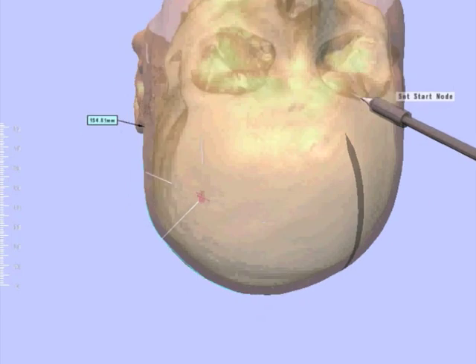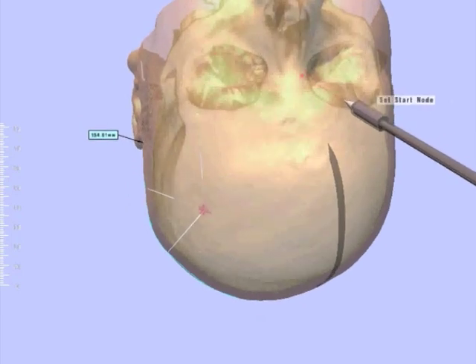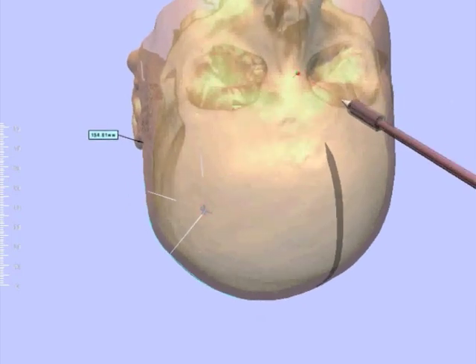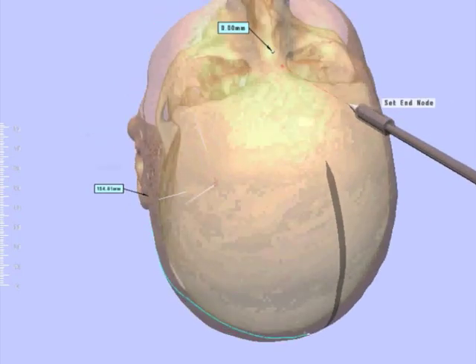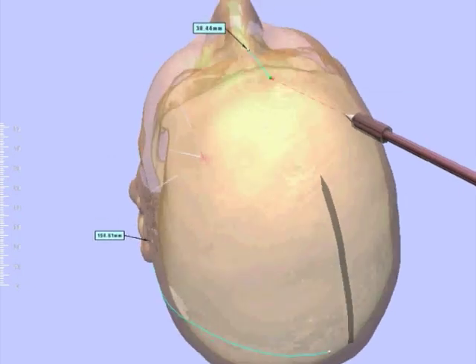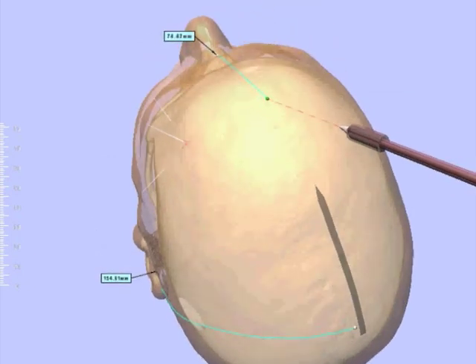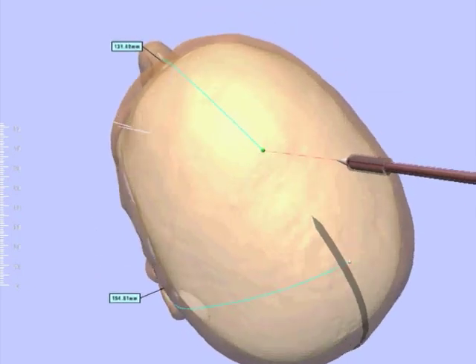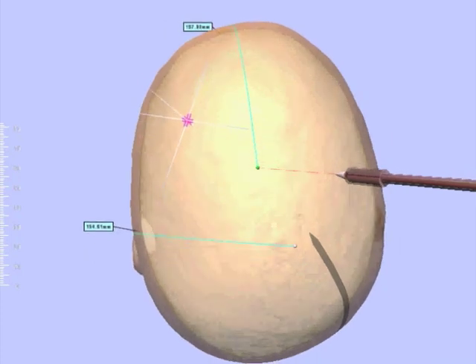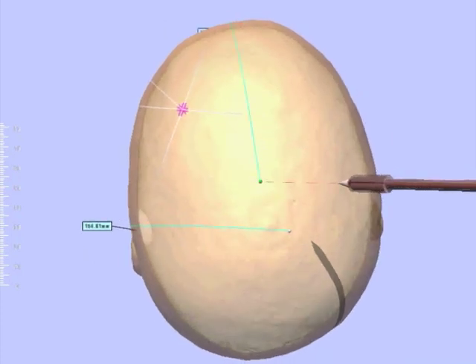The first measurement is then done using the surface measurement tool. We draw a line from the nasion in the midline until it reaches our first auxiliary line at about 19.5 cm.